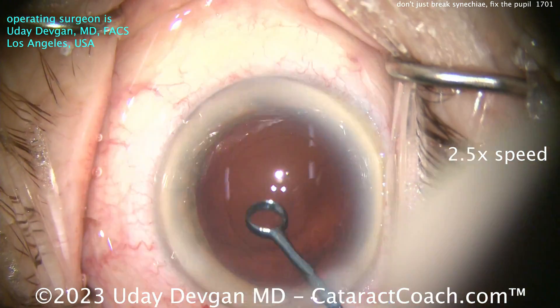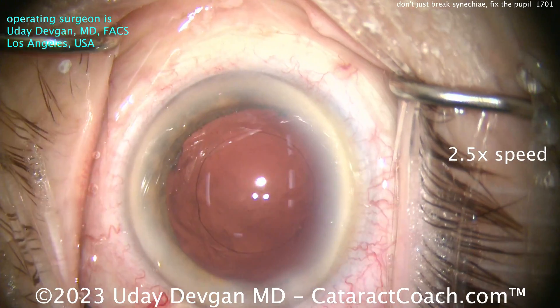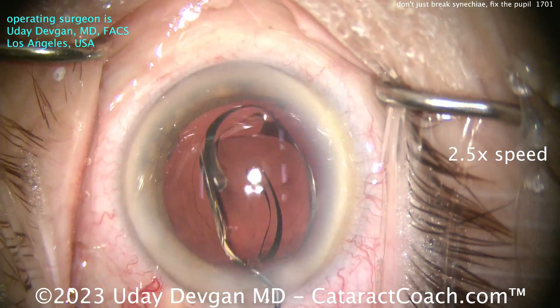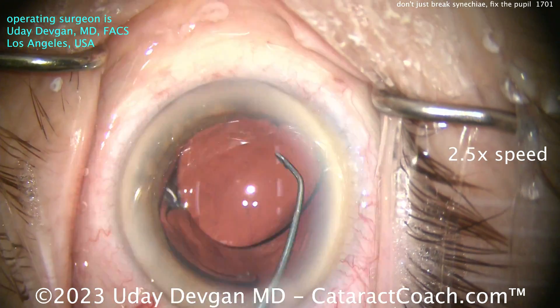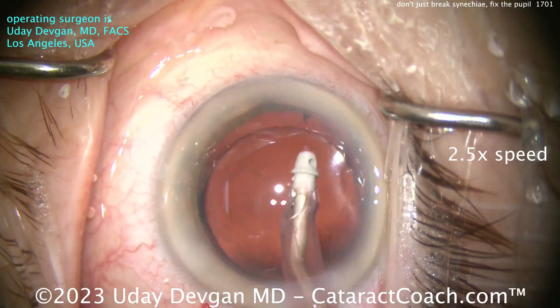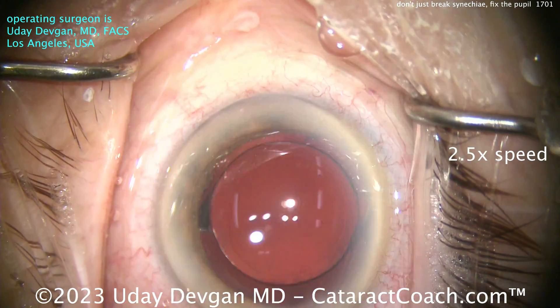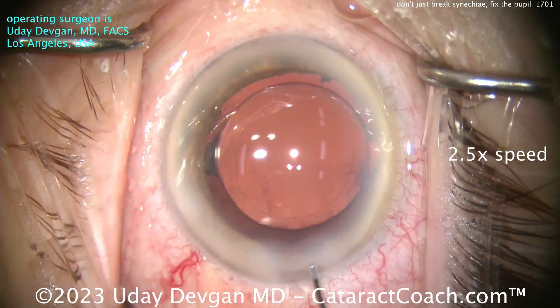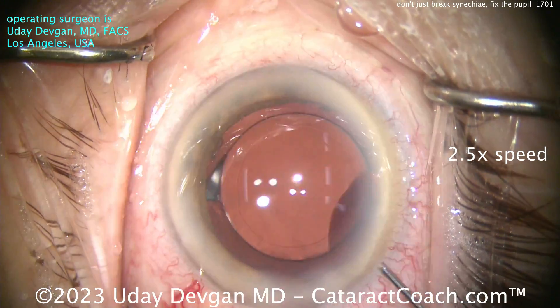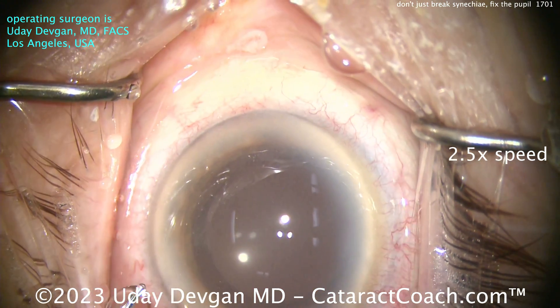Here at the end of the case, we'll put the lens in the capsular bag. I do want to do a little bit of capsule polishing — we want to minimize post-op inflammation. There will be some extra inflammation because we manipulated the iris, so let's put some triamcinolone in the anterior chamber at the end of the case. We have videos on Cataract Coach on how to prepare that — go to cataractcoach.com and search for triamcinolone. It's a very low-cost option. So lens in the bag, nice overlap with the optic, nice good-sized rhexis, seal up the incisions. About a milligram of triamcinolone in the anterior chamber — it'll stay around for just a few days — and that'll really help quell the inflammation.